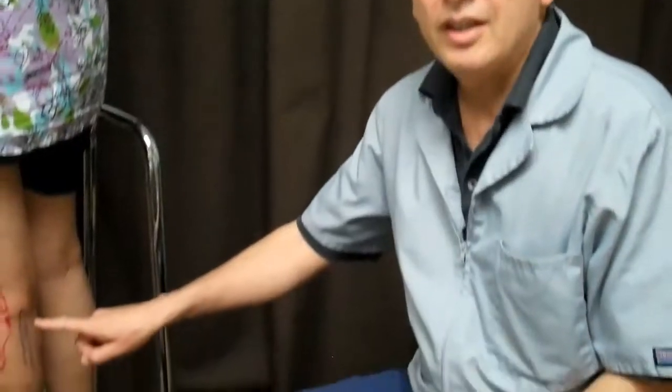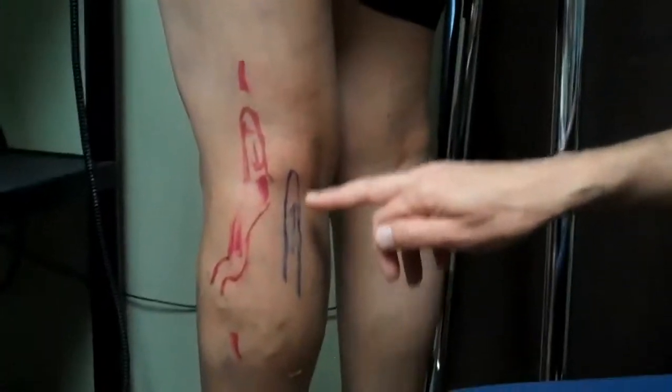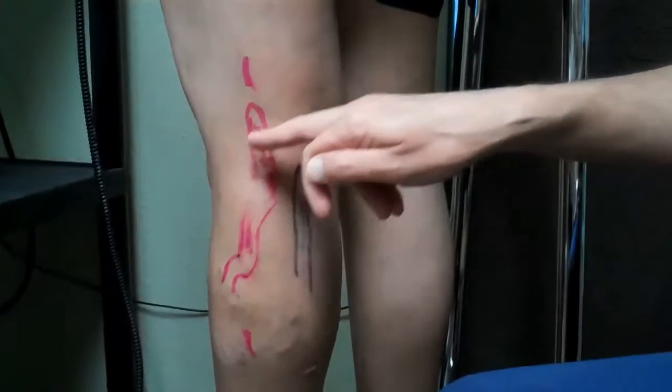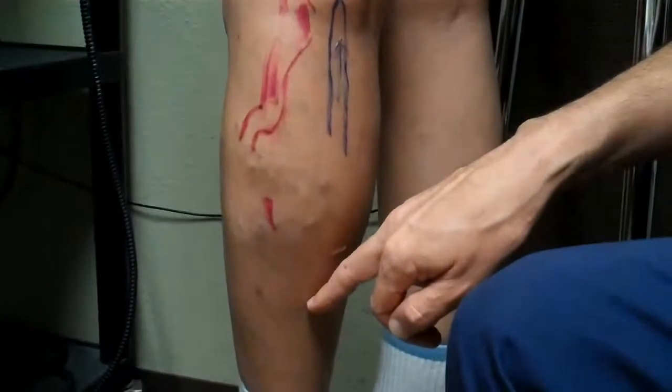Our patient here has a pain on the side, and you can see varicose vein on the side, and when I do ultrasound, the short saphenous is normal, but then there is a perforator in the very lower posterolateral left thigh or lateral to the knee. There is a perforator that is causing reflux here, which is not in any textbook, and for the last 10 years in conferences and everywhere I have tried to bring attention to this vein, and I hope people are starting to look for this vein. Let's look at the ultrasound now.